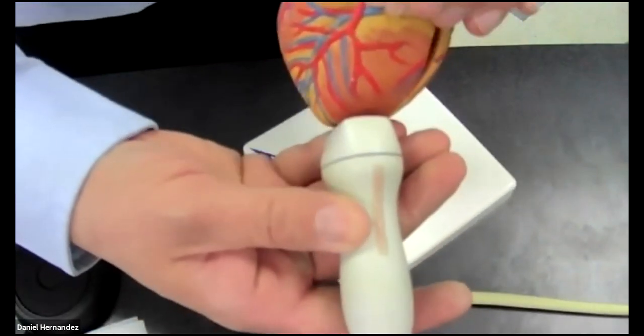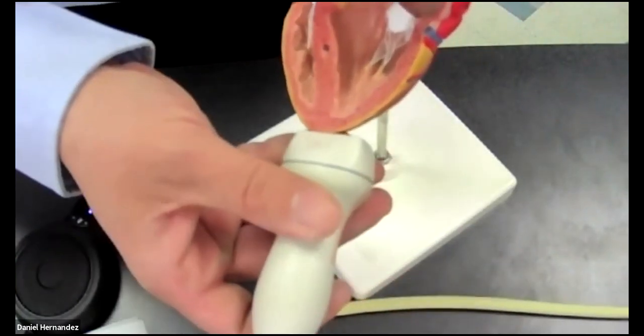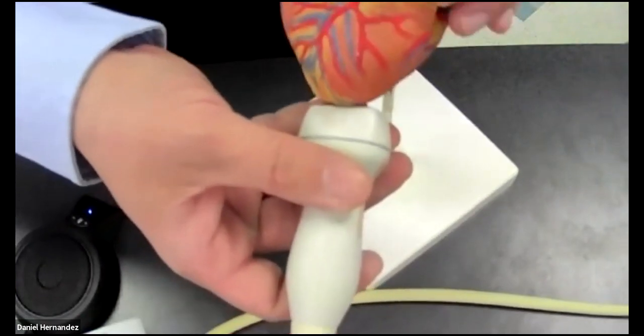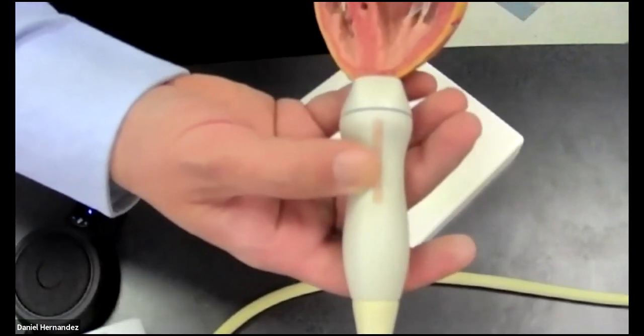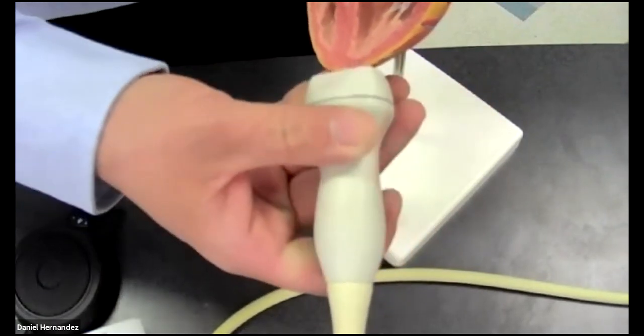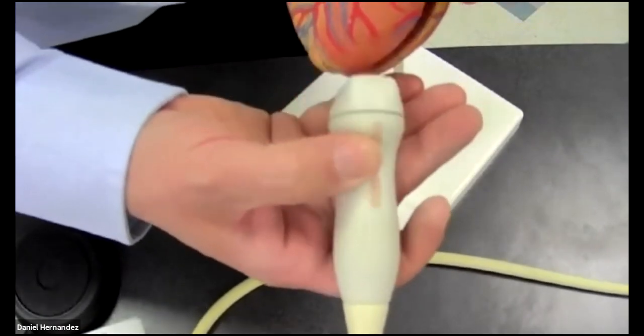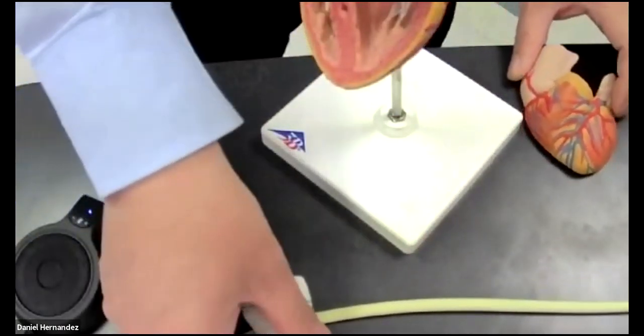I was rotating through and I was like, oh yeah, it makes more sense now, which is the lateral wall and lateral septal, and then anterior, inferior when you start rotating through your different views. You get a good appreciation of what it really looks like with the heart and what you're seeing on your screen.